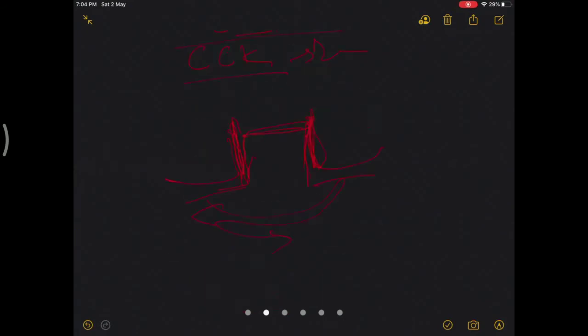The indication for this is very, very precise: you will have to have collaterals. You cannot use it where they are torn, degenerated, or traumatically torn, but you feel they're insufficient or there is difficulty in balancing.